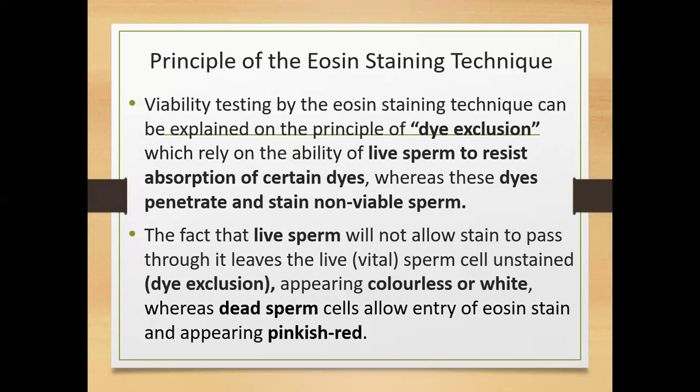Even though you have eosin nigrosin tests, the actual staining is based on the action of eosin. So the nigrosin gives a background staining.